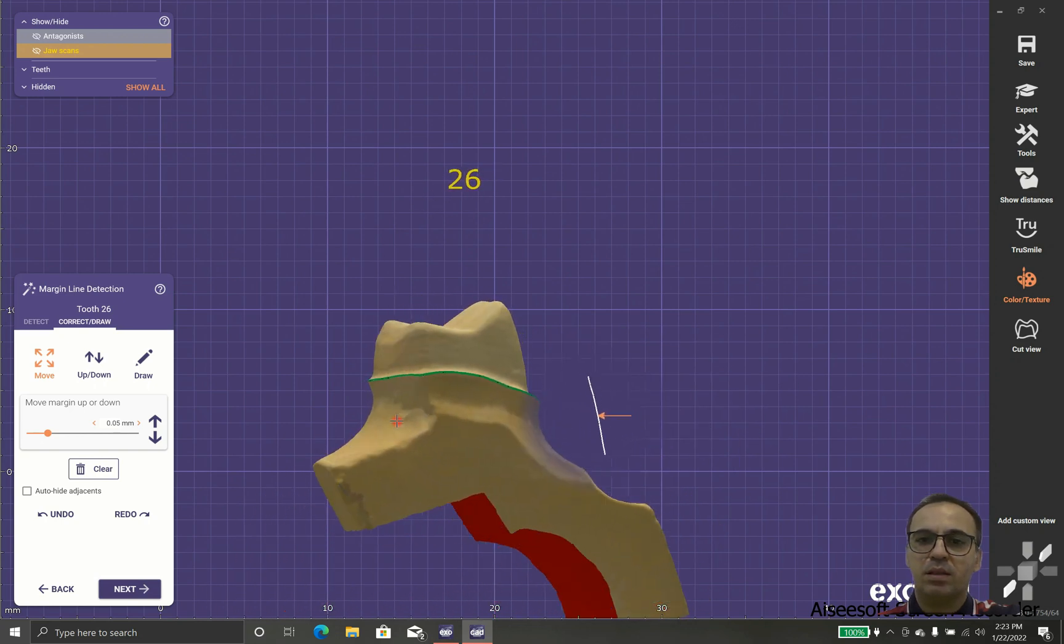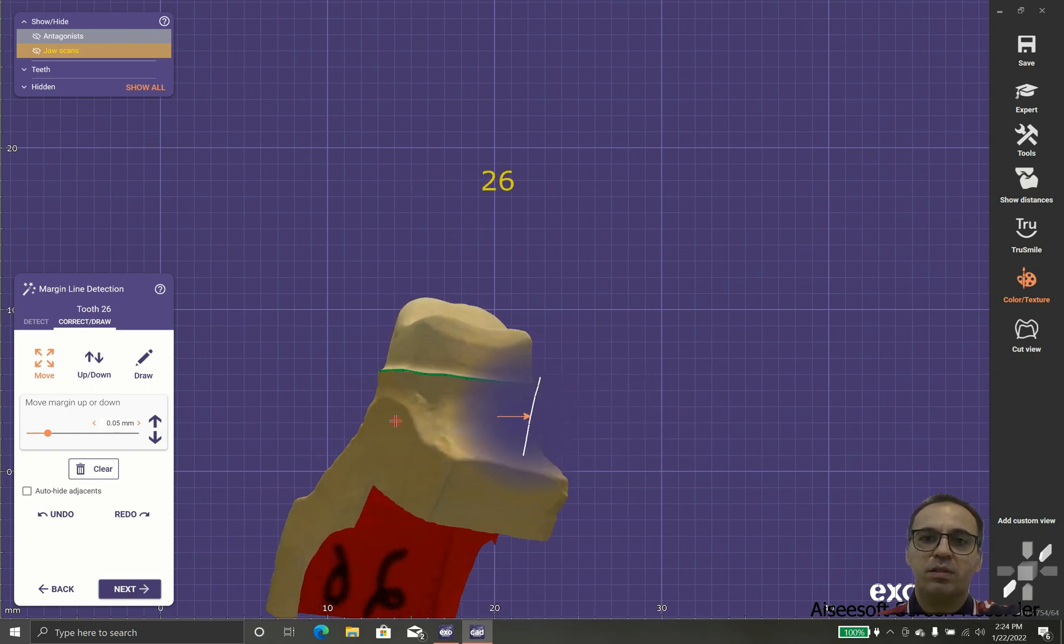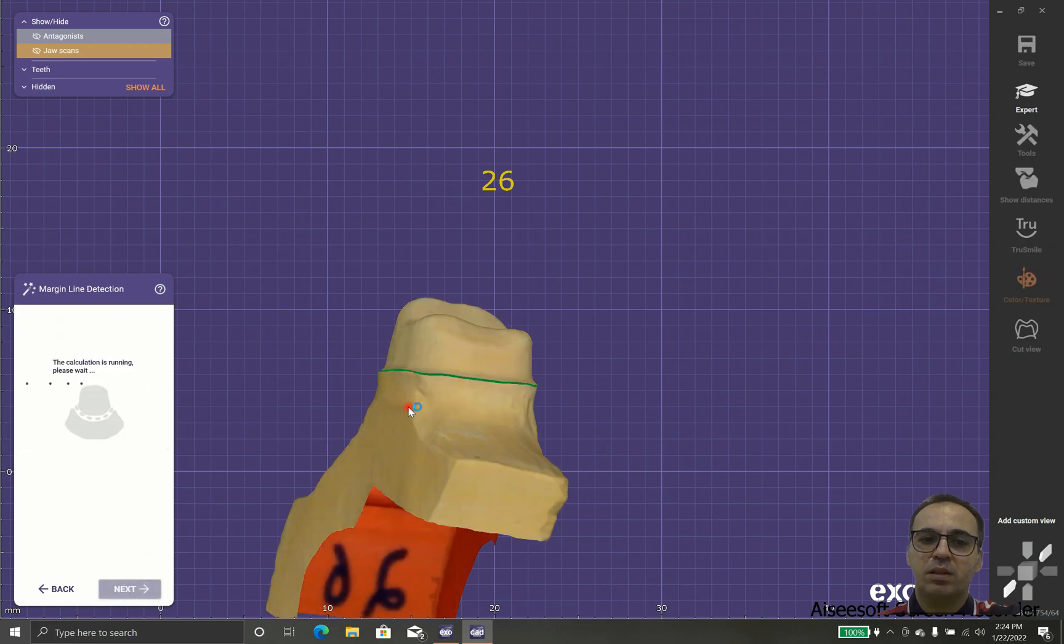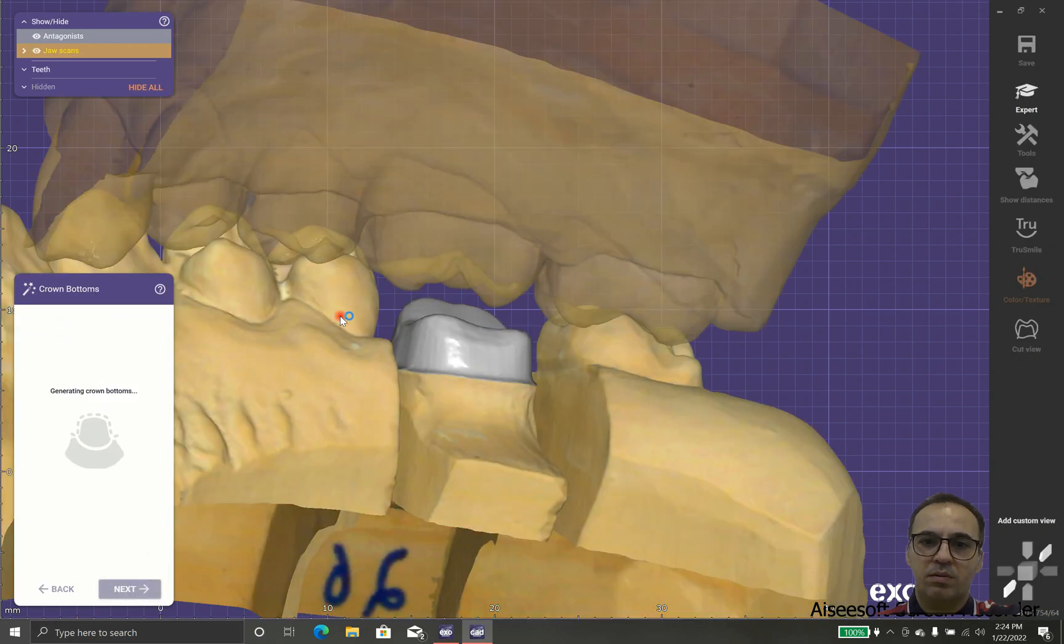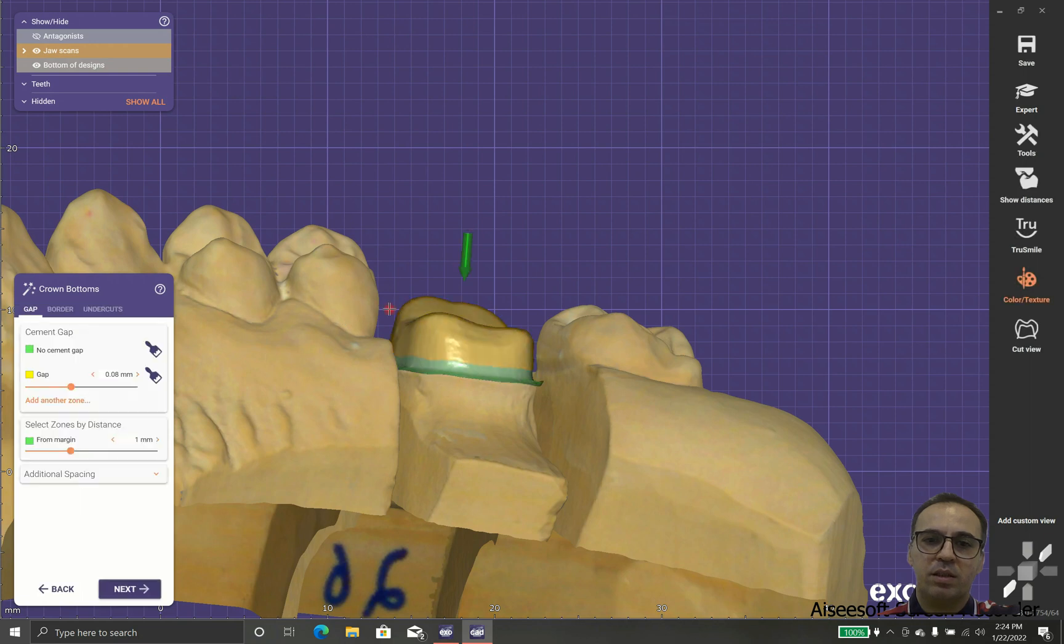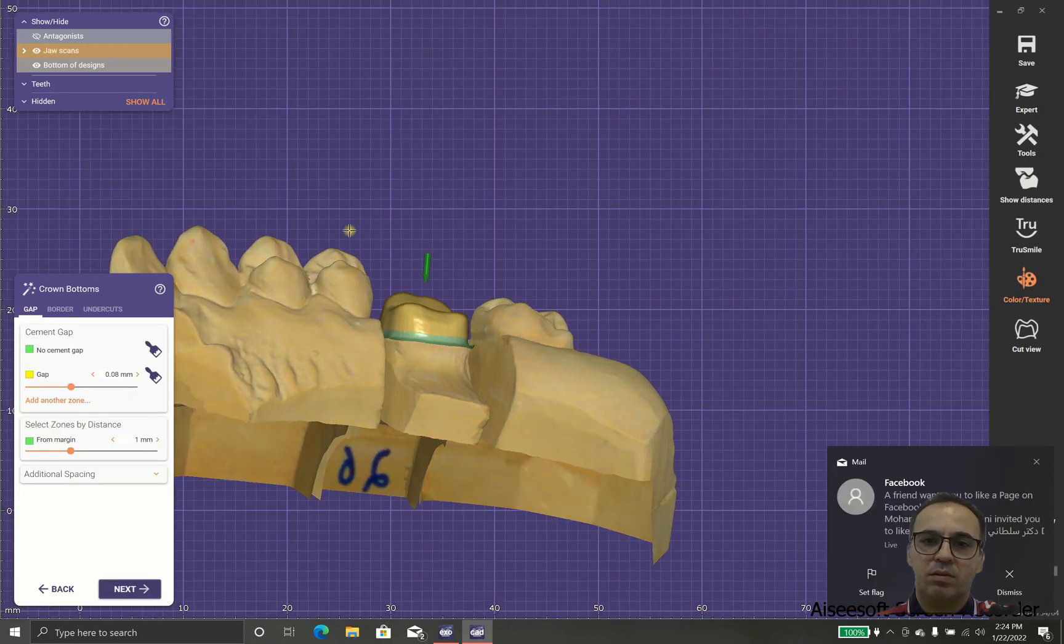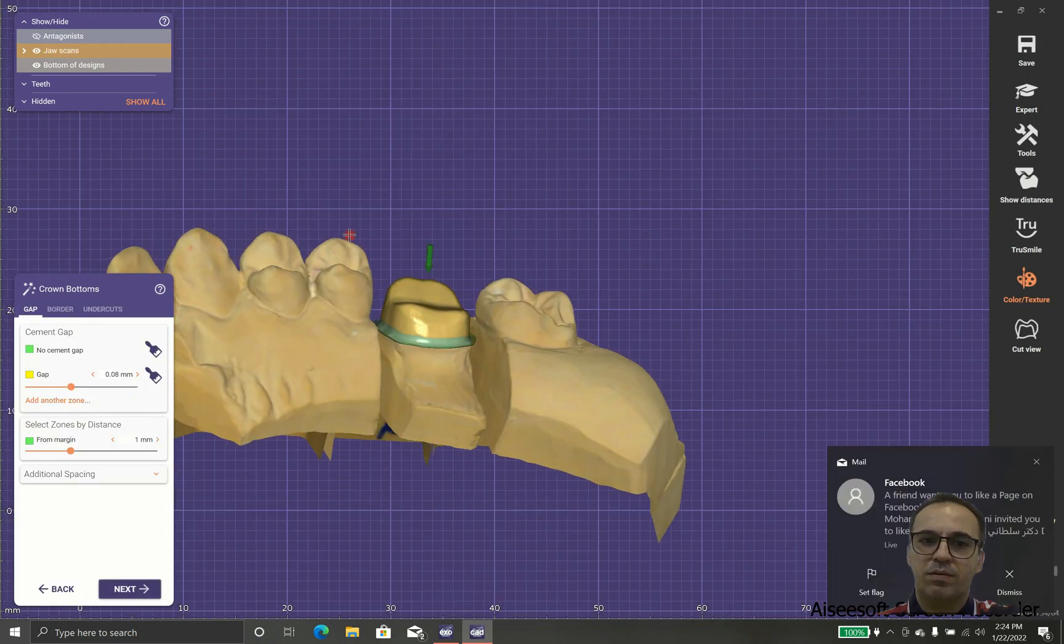So when we finished and we are happy with the margin, we check it again and we will be sure that everything is fine.